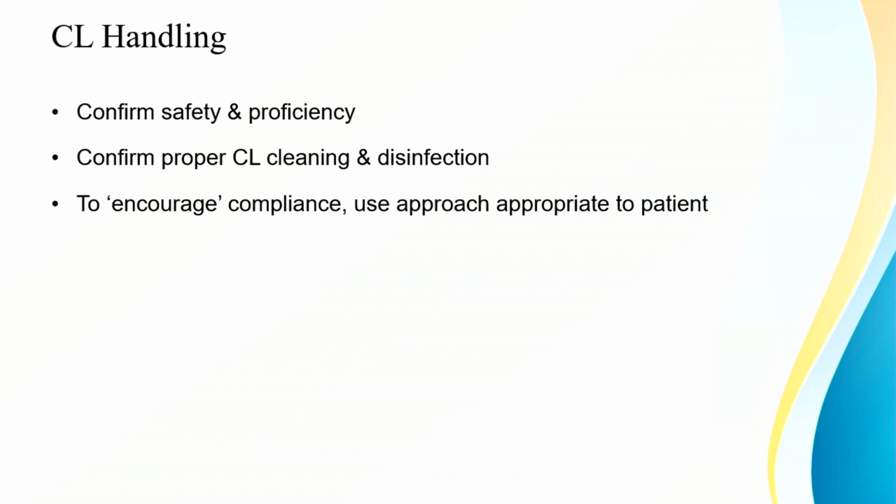Initially we ask the patient to wash their hands before touching the lenses. They have to wash their hands, then dry them with a kerchief or a tissue, then touch the lens. They shouldn't touch the lens with a wet hand. Then you have to clean the lens first with the rub and clean technique, and then rinse the lens again. Then you need to insert it on the eye. After removal, the same technique: you have to clean the lens with the rub and clean technique, not only a circular motion, but a cross-like plus manner. Then rinse the lens again, then store it in the lens case.